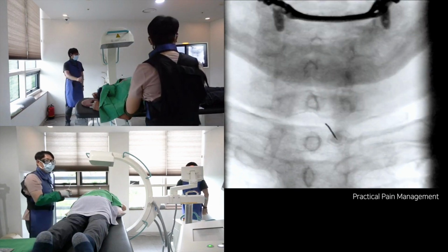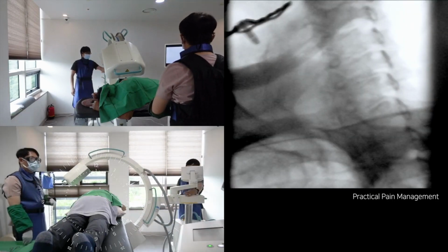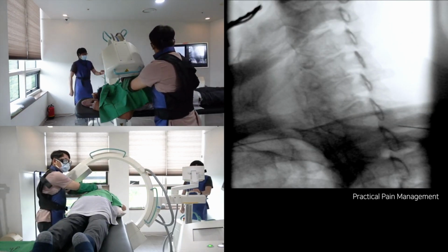I personally favor the parasagittal epidural approach, which provides added benefits for treating unilateral foraminal, subarticular stenosis, and paracentral or lateral types of HCD. At this point, I'll need a contralateral oblique view.